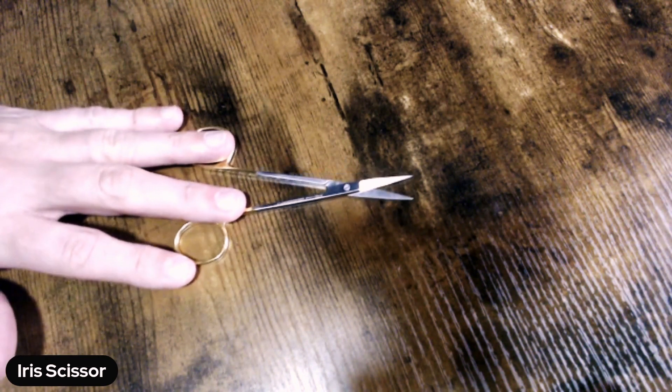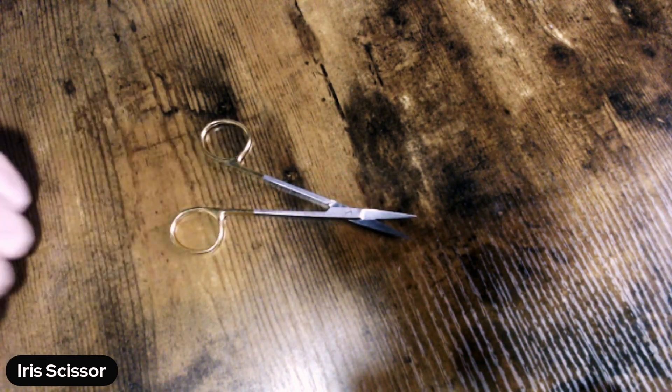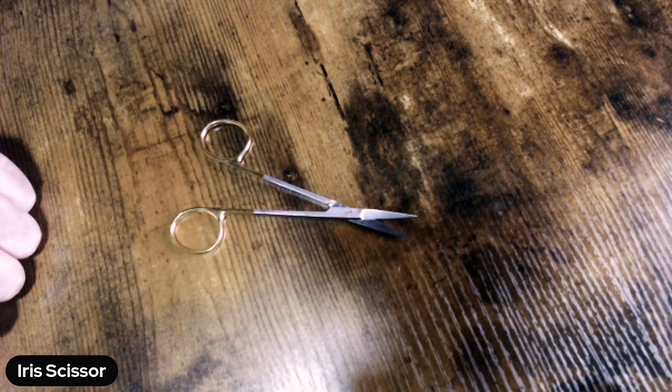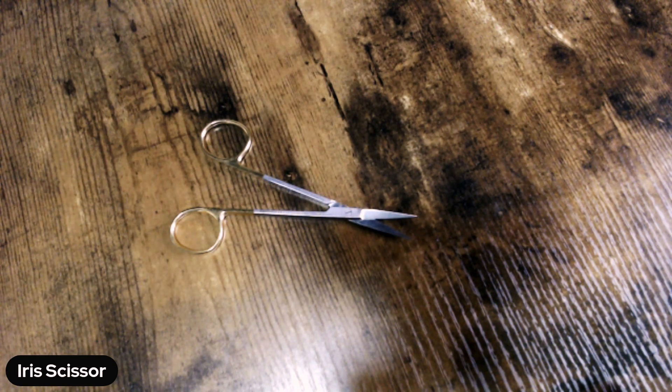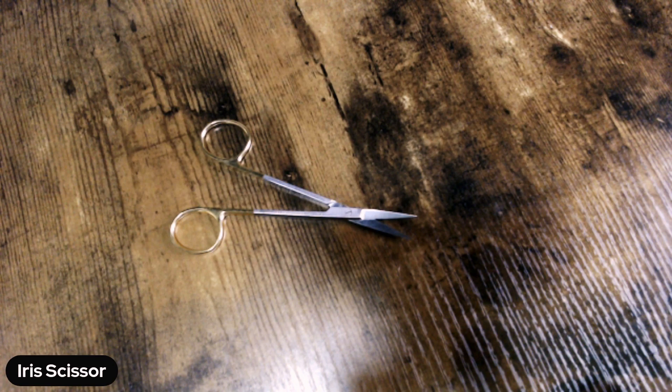This particular device again is a 4.5 inch iris scissor, straight, sharp-sharp with tungsten carbide cutting edges. Thank you for tuning in today, and as always, keep fighting dirty.